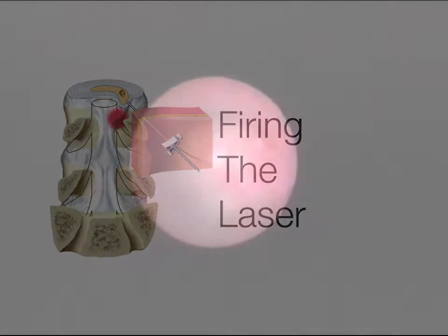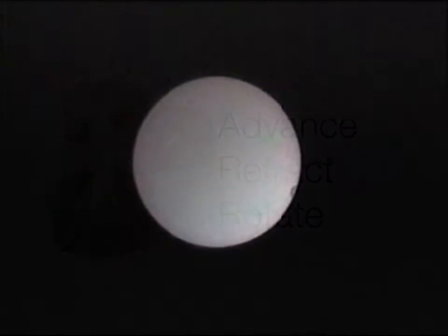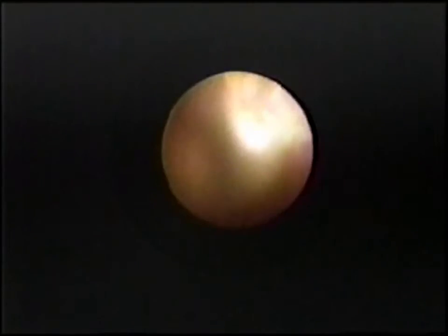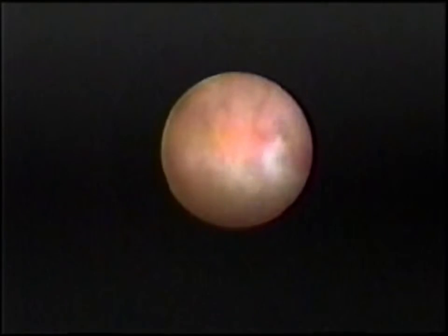Fire the laser, gently advancing the endoscope. Rotate the endoscope to enlarge the opening. Keep the tip of the laser fiber in view. For much of the case, you will simply be advancing and retracting the laser fiber, rotating it to reach different quadrants. While moving back and forth rotating, you might be concerned that the cavity does not seem to be enlarging. You get this perception because, as you vaporize nucleus pulposus from the disc center, more nuclear material herniates itself into the cavity. This process will continue for most of the case. When you have vaporized most of the surface nucleus, the cavity will finally begin to enlarge and you can begin to deflect the endoscope. Deflecting the endoscope tip is reserved for later in the case. Whenever deflecting, be sure not to pull the endoscope back, as the working channel's distal edge can shear off its tip. Even a small cut in the endoscope shaft can cause a leak, seriously compromising the flow of irrigant and cooling to the endoscope tip.